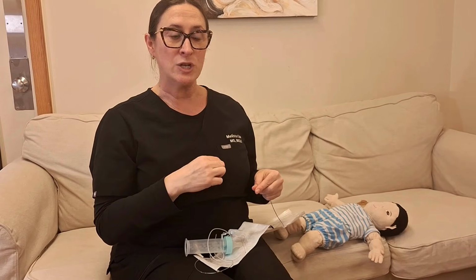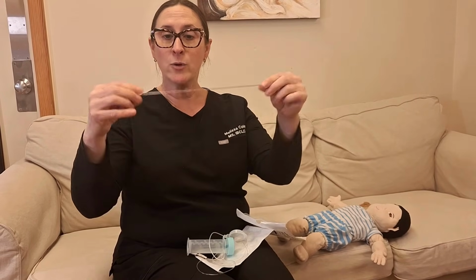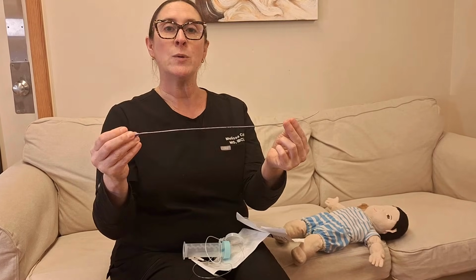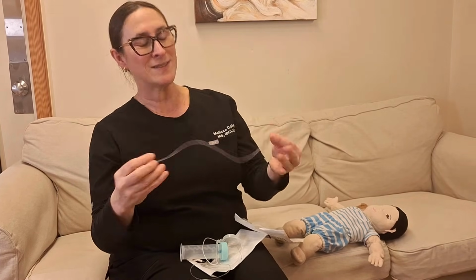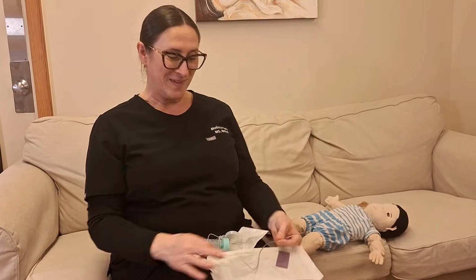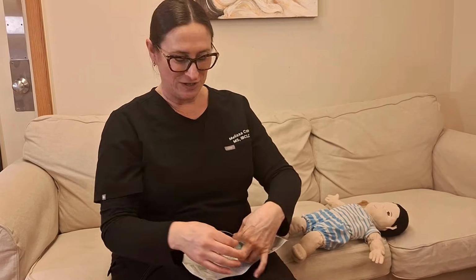For parents and babies that get into a groove with at breast and chest supplementing and they want to do it more long term, there are higher quality plastics. So this is a polyurethane tube, for example, that's meant for longer term use. So if you have questions about tube lengths, diameters, or materials, talk to your local IBCLC or connect with us, Luna Lactation, if you need some more resources or ideas.